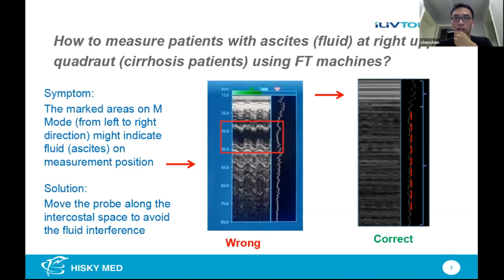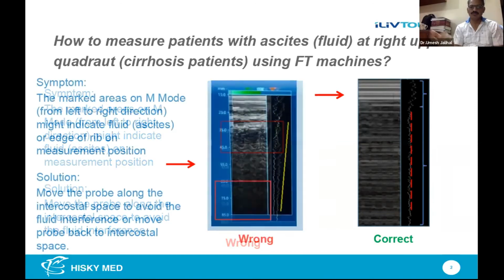It has steady layers and has the gray color from top to the bottom. There's no black areas or white areas. Those are interferences.